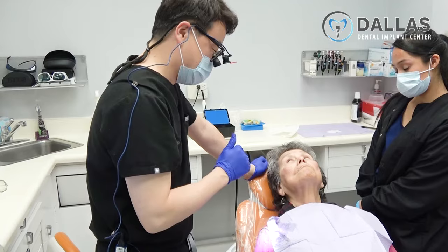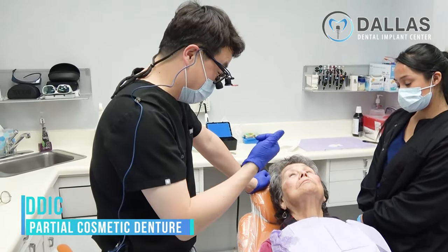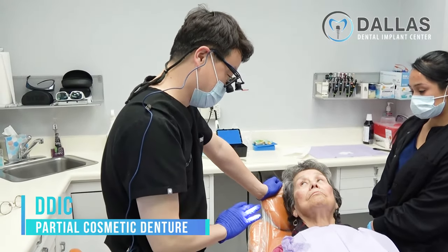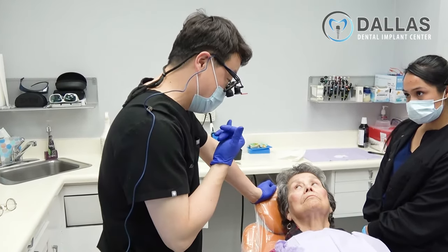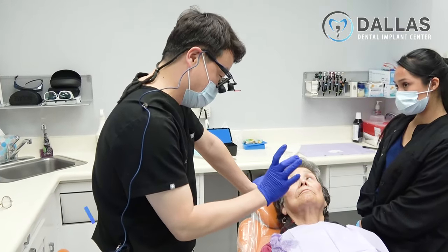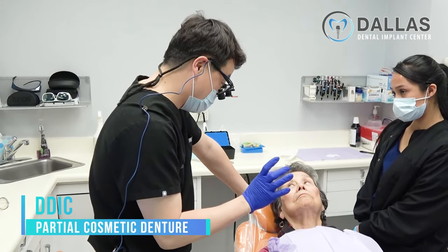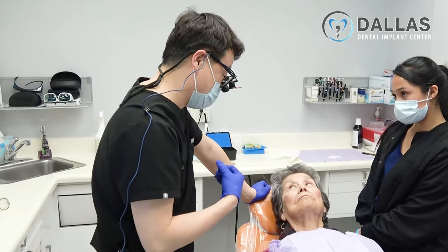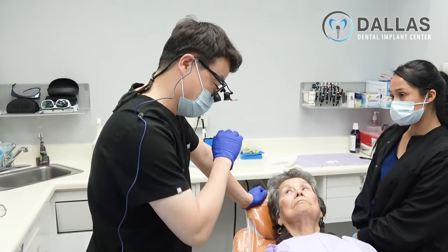But as you know, once you use it, it gets better and better. Alright, I removed some retention in case of a problem, so I will leave it like this. First thing, you need to watch and monitor your pain, because the clasp holding your denture has a lot of retention, so you may feel tooth movement or a lot of loading forces, and that can become pain. Big no-no. I will take it out and then give some relief. But otherwise, you'll be fine.